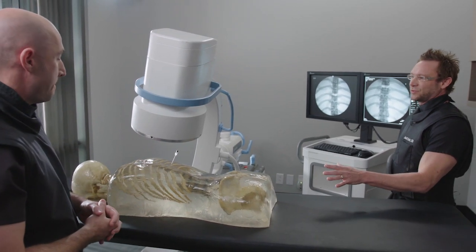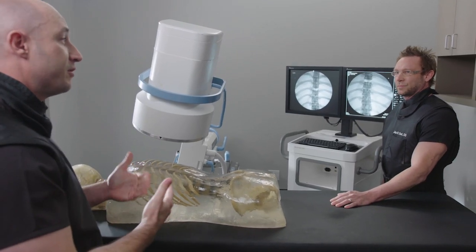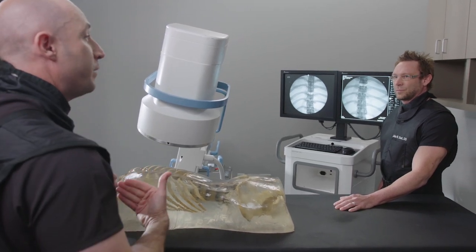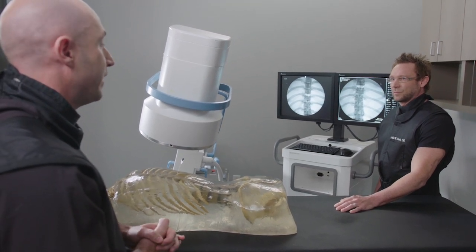And the nice thing about Astras is that you can practice performing this specific procedure an endless number of times before you ever practice on a live person. So I know when I was training, there were certain procedures I was very comfortable with. I was very adept at, and certain ones I was not. So being able to go to that specific challenge for me and practice it over and over would have made a big difference in my training phase.